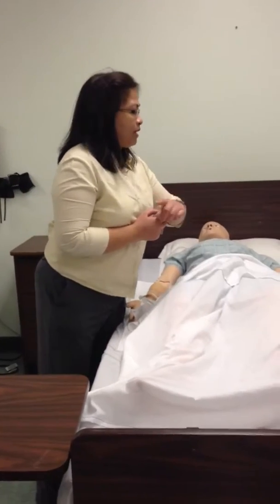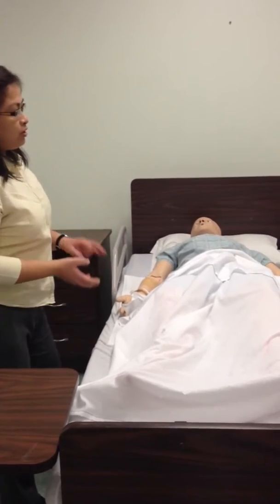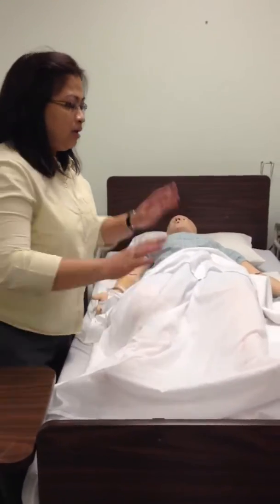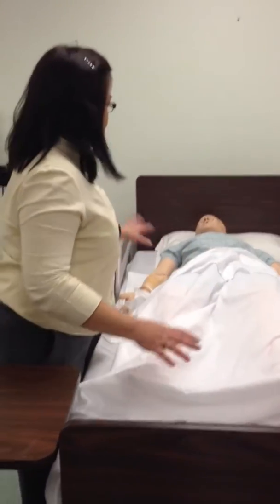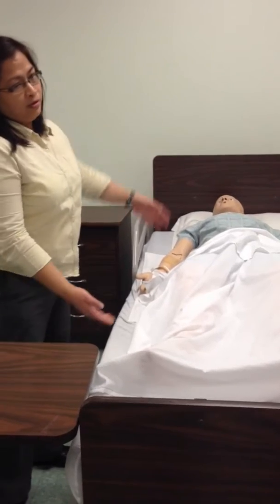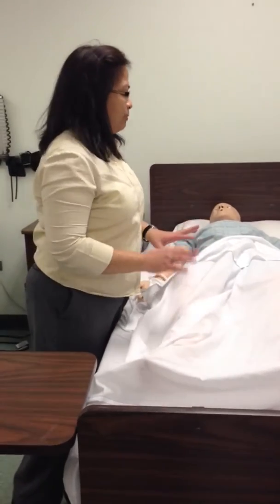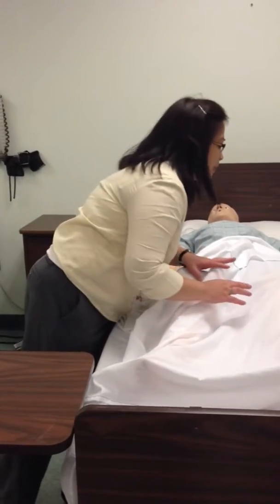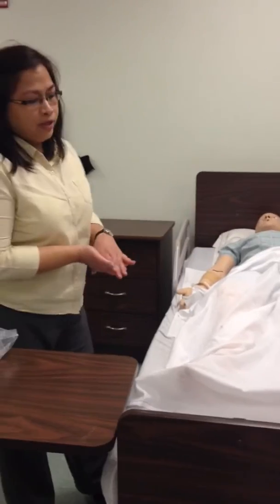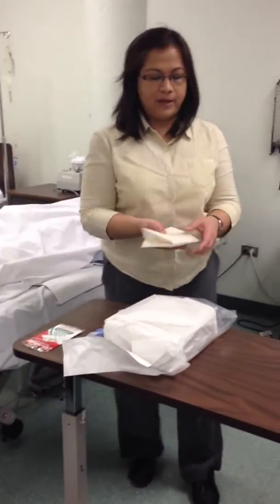You provide privacy, increase the bed height. Make sure that you increase the bed height. These new beds don't go up too high. This is the highest, I think. But the other beds in the other room go really high, like over here, because they want to see good body mechanics. They don't want you bending too low. All right. So after that, you're going to make sure that everything is in the right place.